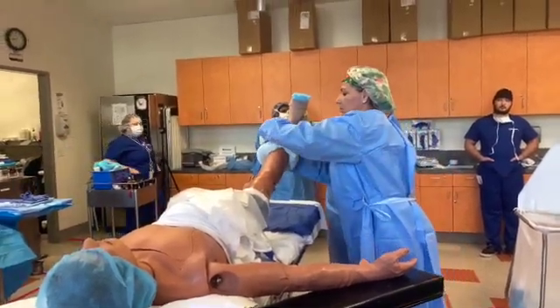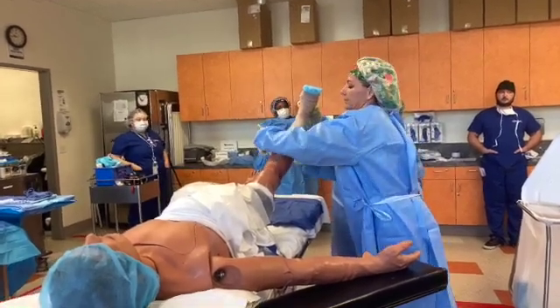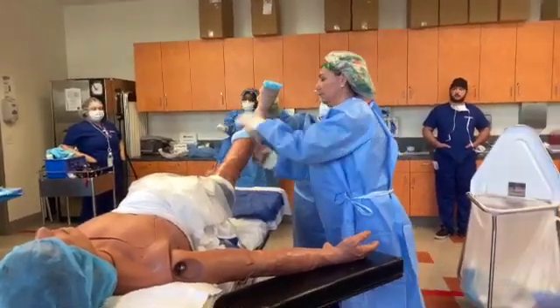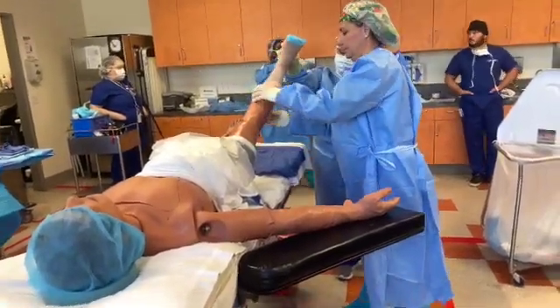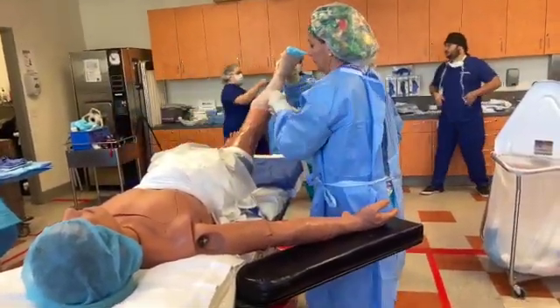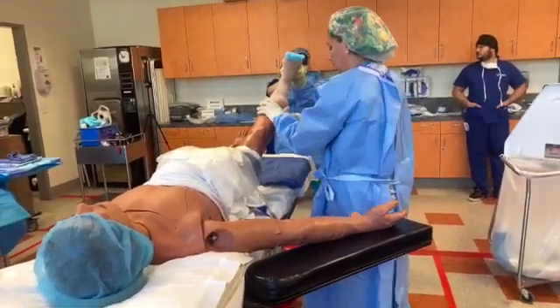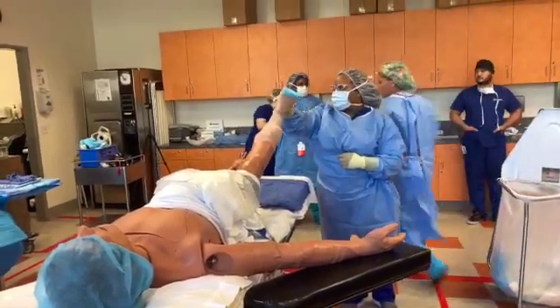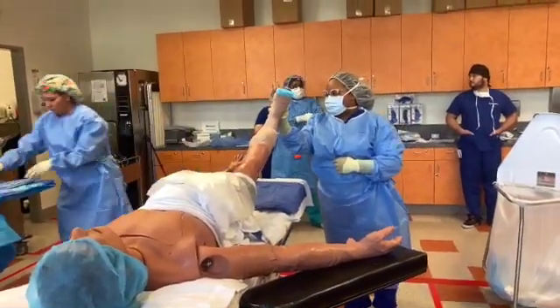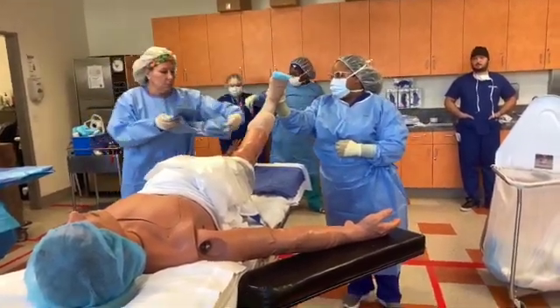You don't have a high probability of getting contaminated versus putting a half sheet down first. So it depends. A lot of times we do it simultaneously. What would normally happen is I'm already scrubbed in. While she's doing that, I put down the half sheet while they're wrapping, simultaneously. But if for some reason it's just the two of them, there's no problem doing it this way either, as long as you're watching to make sure you don't contaminate.